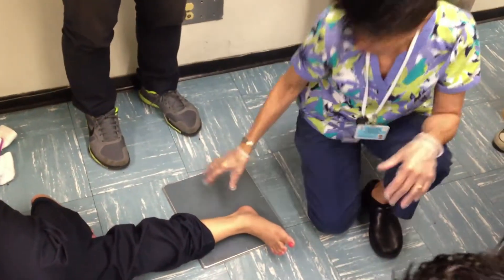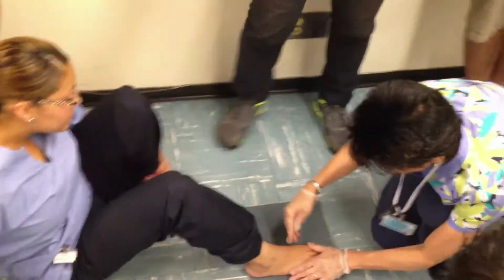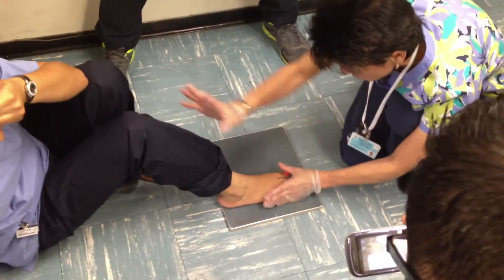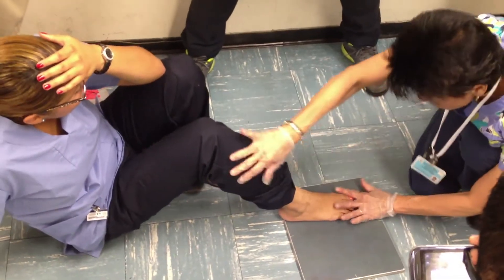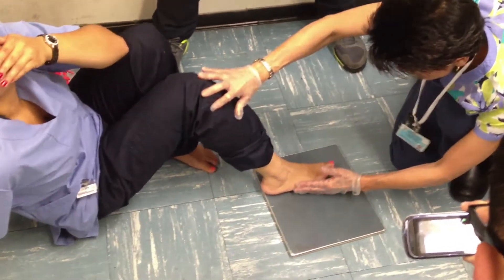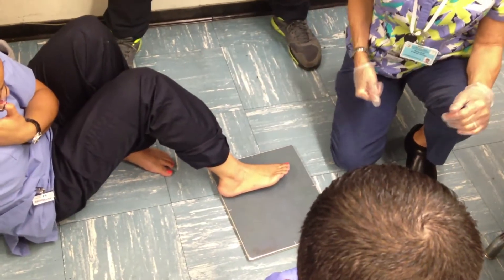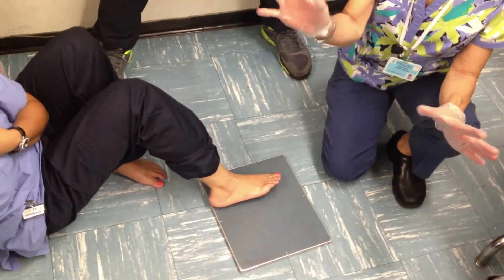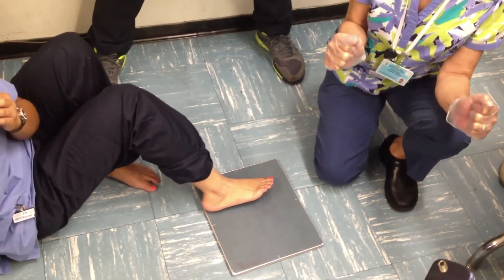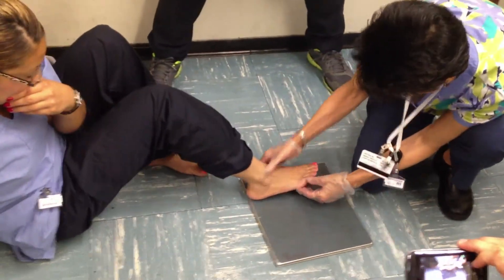So what do we do? Foot, ankle, heel, and toes. Bend your knee — toes. We're going to collimate, CR is going to be here. AP toes. Like your oblique foot, turn it in — oblique toes. For all toes of the right foot, medial rotation. We're going to do a medial oblique, that's it. Redo your notes on toes — we're just going to do a medial oblique. Individual toes are a little bit trickier. You're going to have to tape the toes apart when you're doing a lateral.